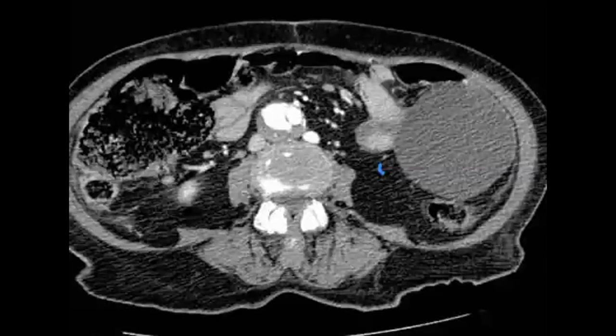If you find a cystic lesion or hypodense lesion, a low attenuation lesion, and it looked like a cystic lesion by ultrasound, then they did CT, and this lesion is related to the bowel, then you can think about what's called a duplication cyst.